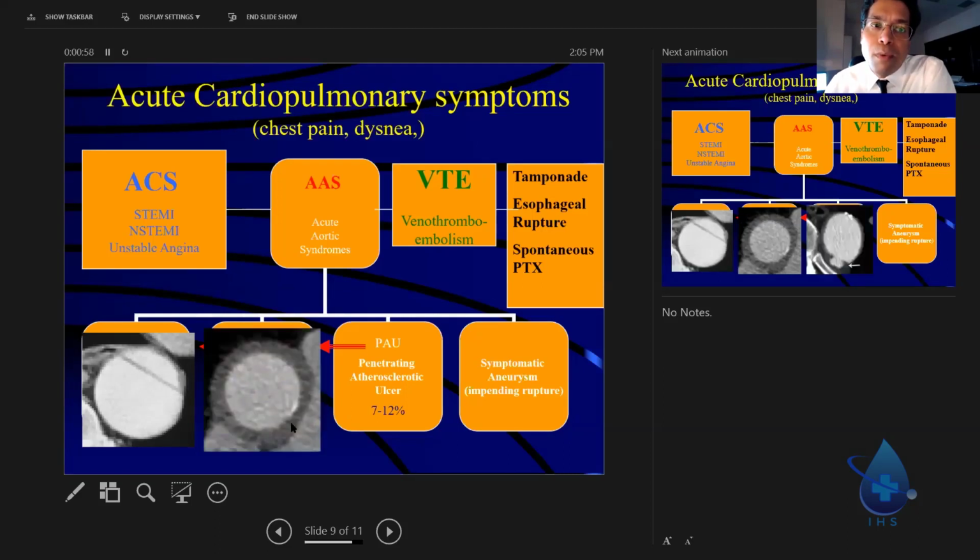Intramural hematoma is the one that cardiologists screw up and miss. And I know why it happens. It happens because the intima is fine and it's subtle. It's in the wall, and many times it looks just like atheroma. If this is thick, like 6 millimeters thick, you probably wouldn't say, that looks like atheroma to me. It's also very smooth. But people call it atheroma when it's acute blood in the wall.